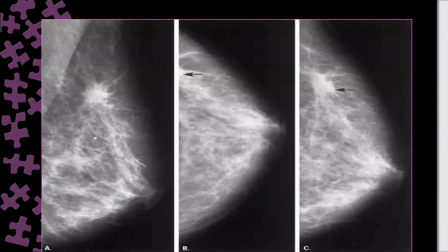Because here the lesion is obviously at the apex of the parenchyma, and most likely I can say it is on the lateral side. From the CC, I am confident that the lesion is lateral. It is posterior lateral. I could not see it well because it is at the posterior end of the parenchyma.